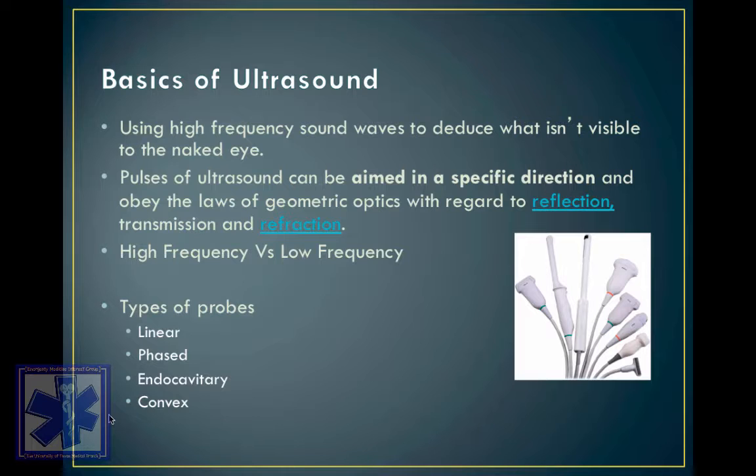And then you've also got your phased array probes. This right here is the one we have here, and that's kind of a catch-all between the two. It makes a nice medium. They're lower frequency, so they don't have great resolution, but they have great depth. So I can see in the belly. I can look at your organs. I can look at the heart a lot better. I can look at your uterus a lot better. But I can't see with the exact same definition that I can with the high frequency probes.